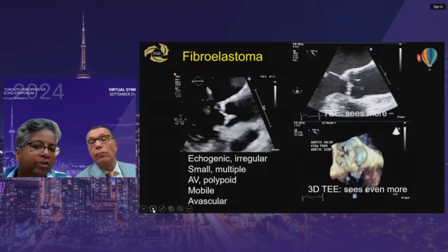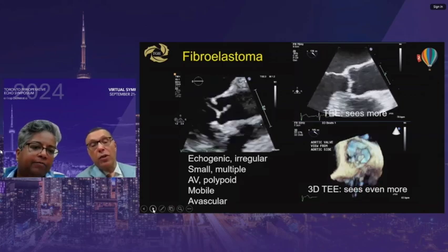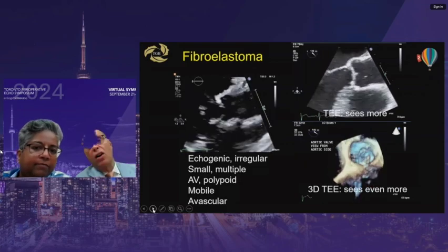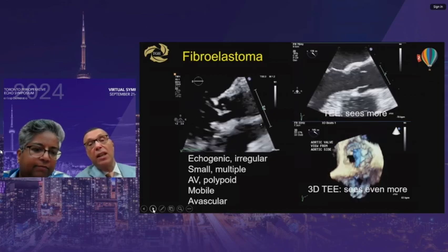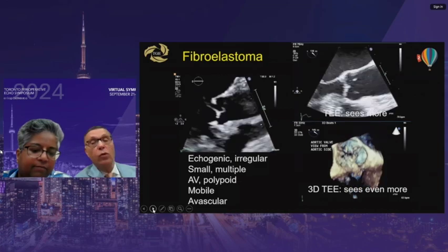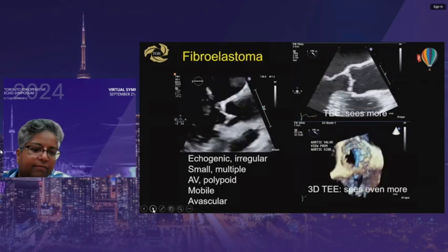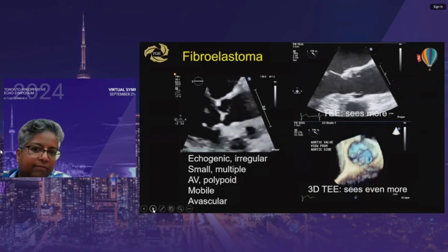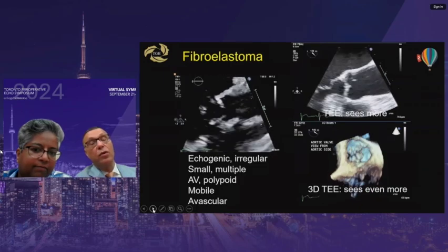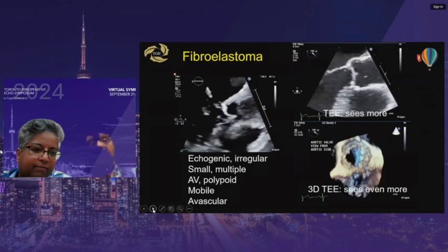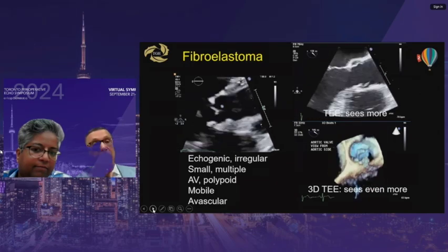Multiple lesions are present on this aortic valve. Reviewing loops carefully — sometimes you'll see what looks like grass on the leaflets, not smooth leaflets. Fibroelastomas can occur in multiple spots. Treatment is not necessarily valve replacement unless you can't get everything off — the approach is to scrape them off and preserve the valve. In young individuals especially, valve preservation is attempted, though other areas with smaller lesions may also be present.